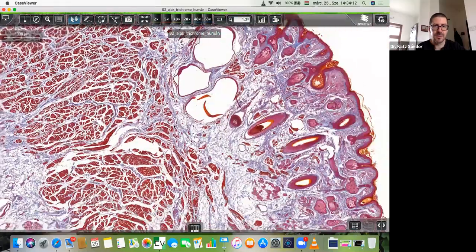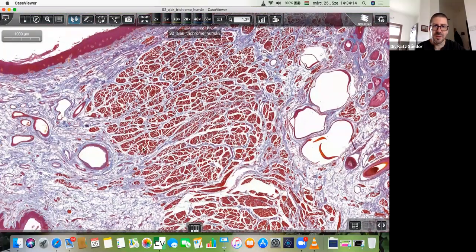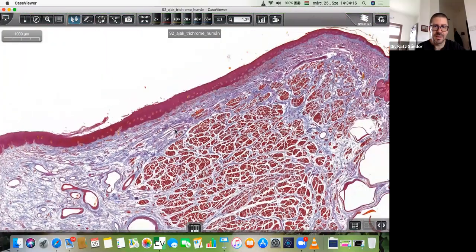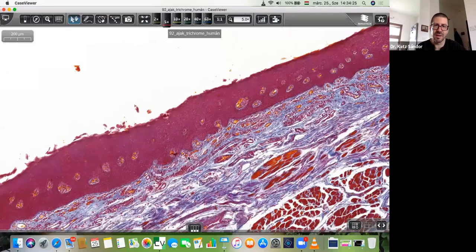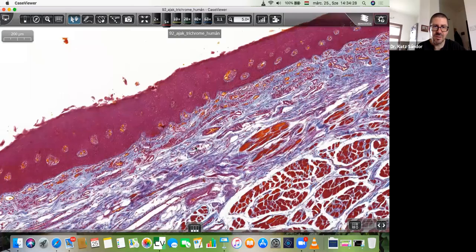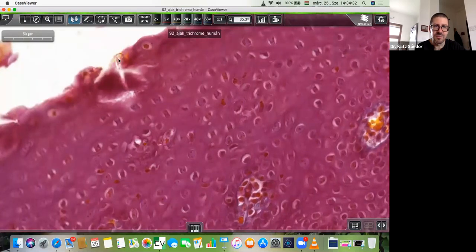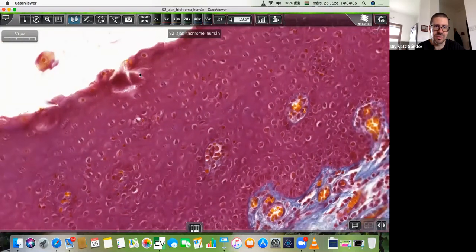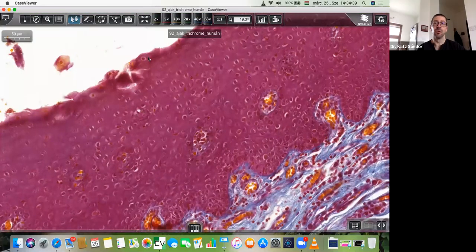Then, second part. Just looking at this, it's a thinner epithelial covering we have, slightly keratinized. At the top we can find some dead layers, but it's much thinner than the normal corneal layer.